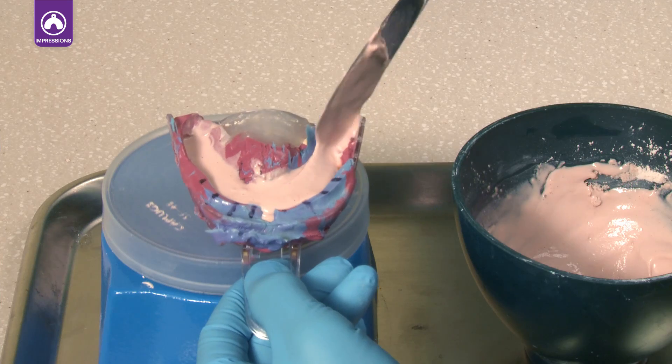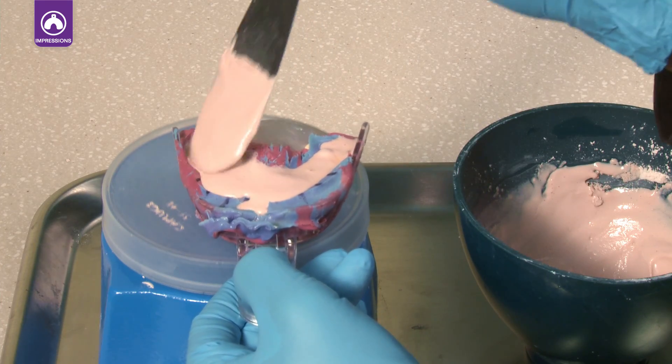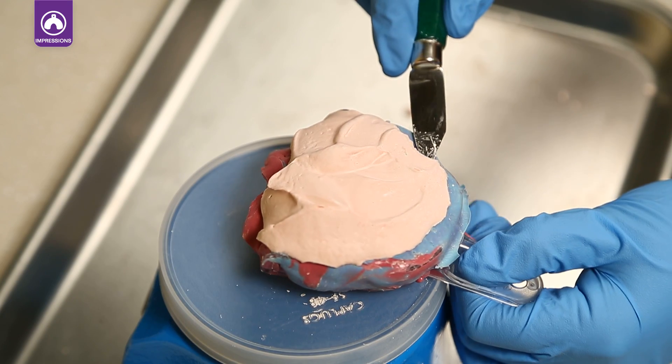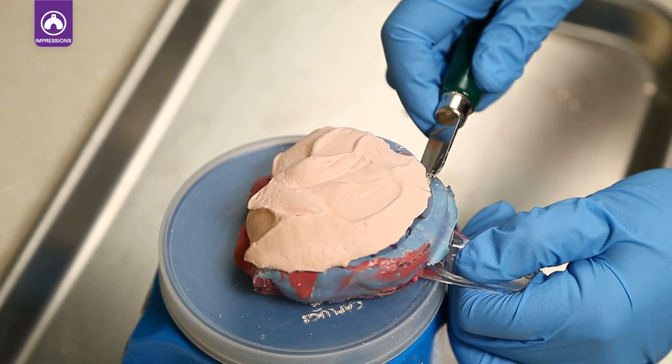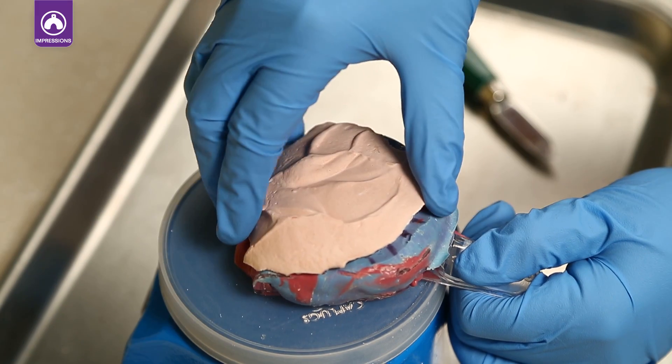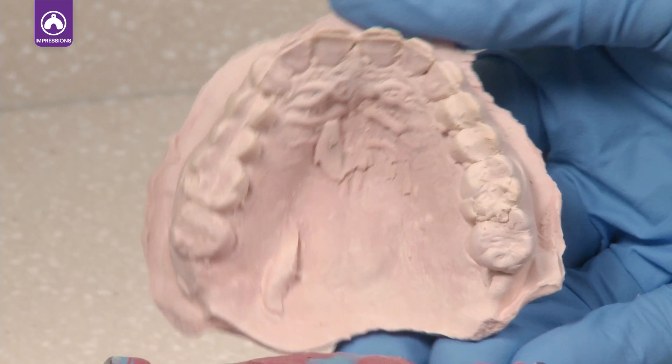The material is hydrophilic not only during application, but also during immediate pouring of gypsum. It contains special reinforcing branched silicone resins for superior tear resistance, so impressions can be easily removed. Its elastic recovery ensures dimensional stability for weeks, allowing you to pour at your convenience.